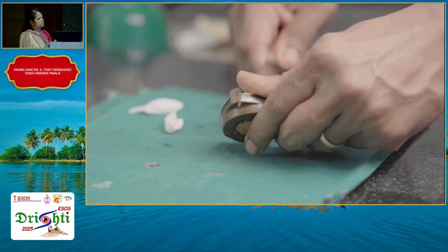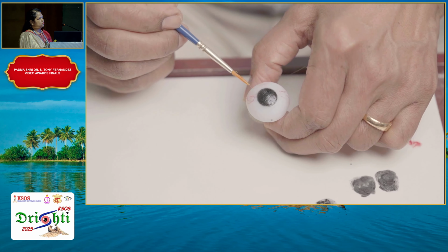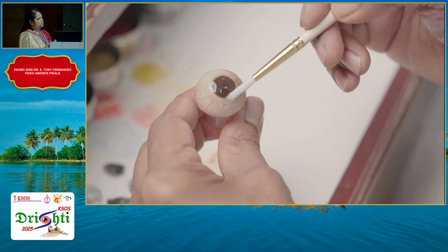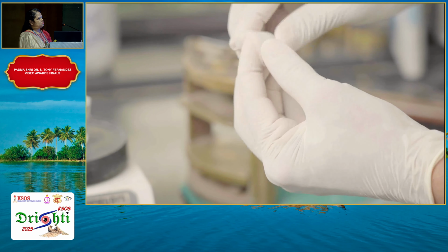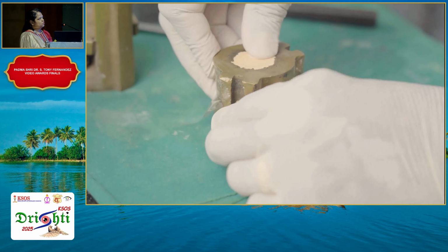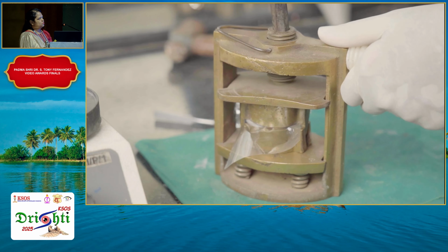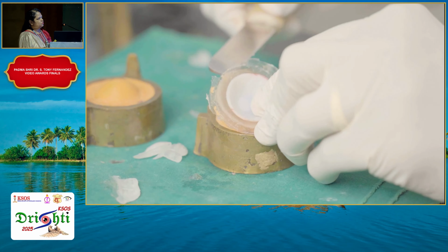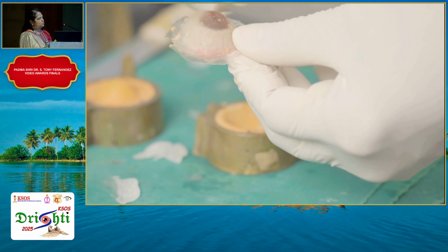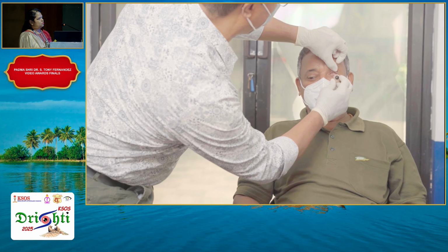Once the curing is done, the scleral shade plastic is taken out, the stem of the corneal button chipped and the surface smoothened. The scleral painting is done. Clear acrylic is prepared. Once the dough is formed, the clear plastic is placed in the plaster mold. This is cured for 1 hour in a 100 degrees centigrade water bath. Once the curing is done, the cast is removed. Then the shell is smoothened and polished. Now the artificial eye is ready for delivery.